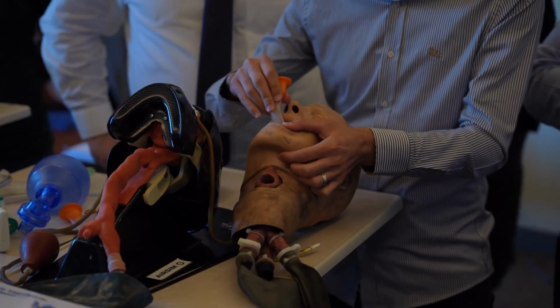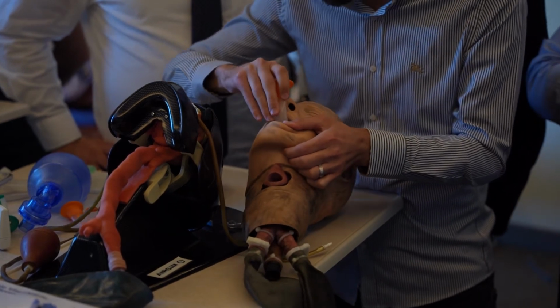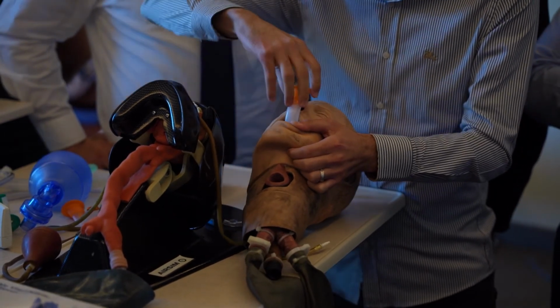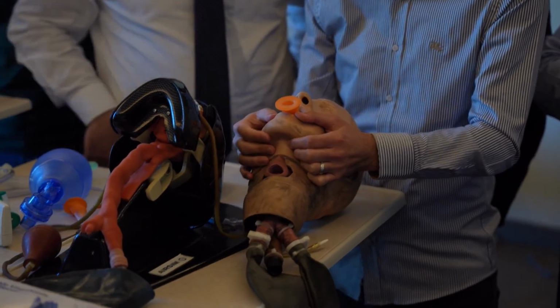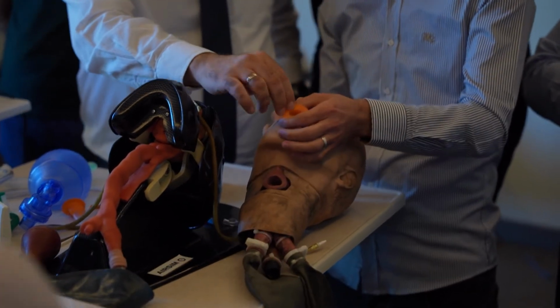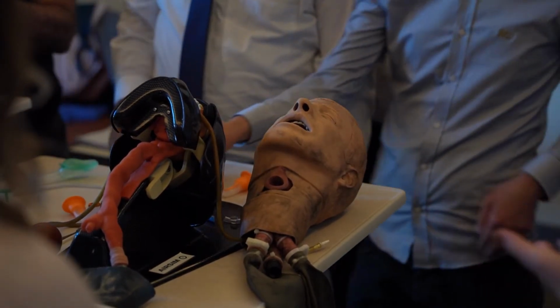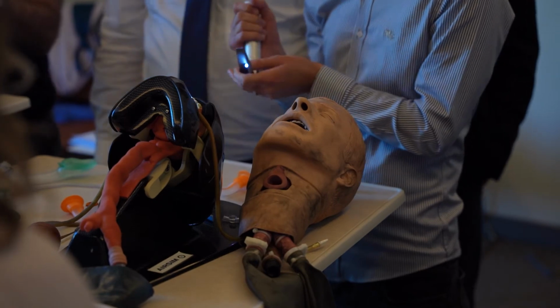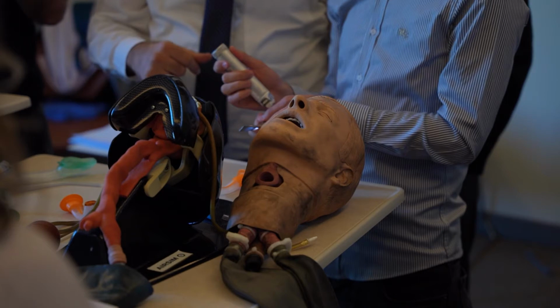Regarding the jaw thrust with the ambo bagging, if you couldn't find the mouthpiece, I will ask one of my colleagues to hold the jaw thrust, and you give the ambo bag. Or you are doing it. Now just look at my hand. When you use this one, you should have a correct mask.